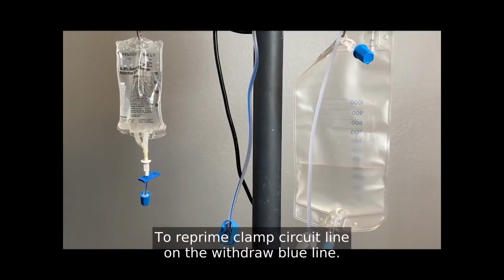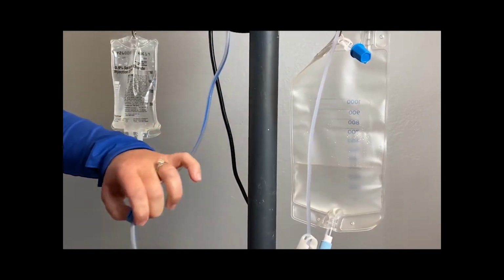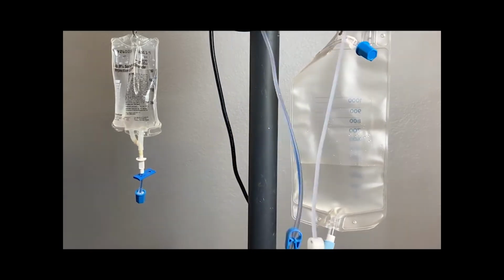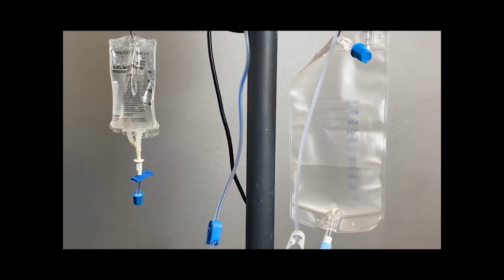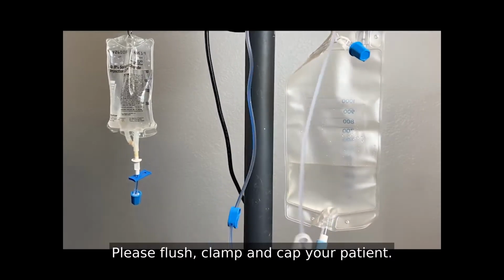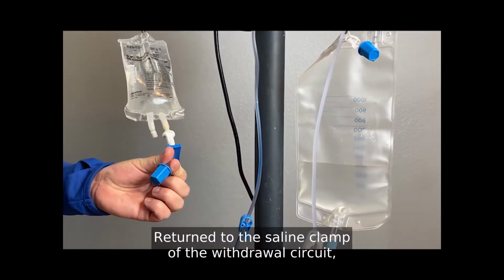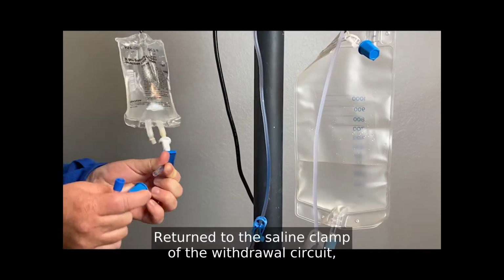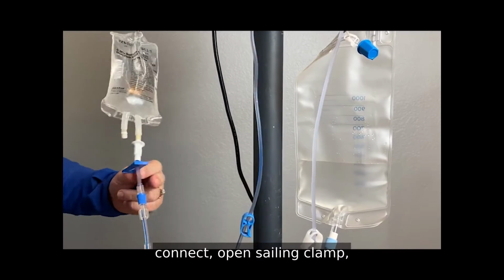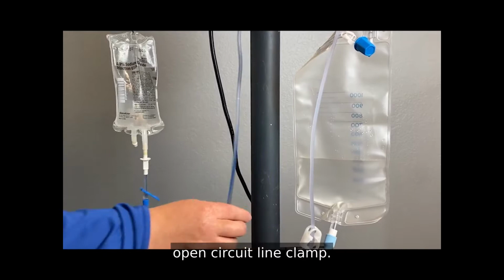To reprime, clamp circuit line on the withdraw blue line. Disconnect from the patient. Please flush, clamp, and cap your patient. Return to the saline clamp of the withdrawal circuit. Connect. Open saline clamp. Open circuit line clamp.